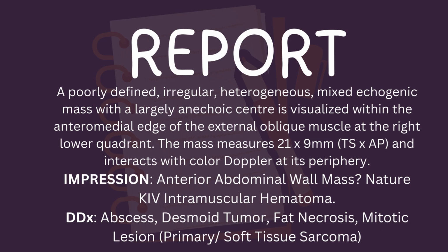Now, the ultrasound is not a definitive diagnosis in some case scenarios like this, so it's important that you suggest other imaging modalities like CT, MRI, or even histology to have a definitive finding on what this could be. But if this is your report of the mass with the ultrasound, you've done a good job.